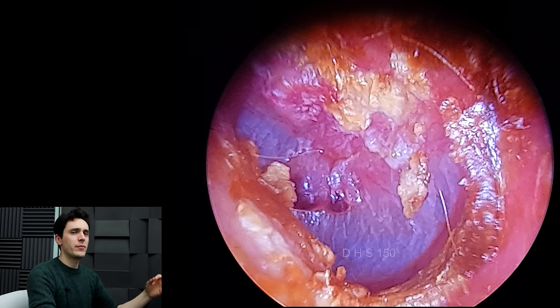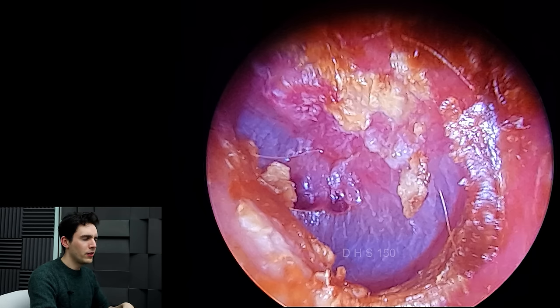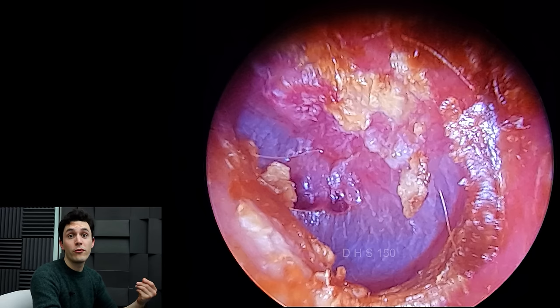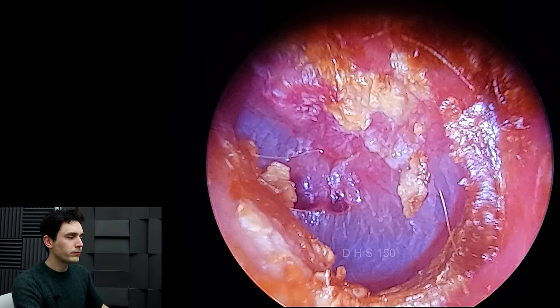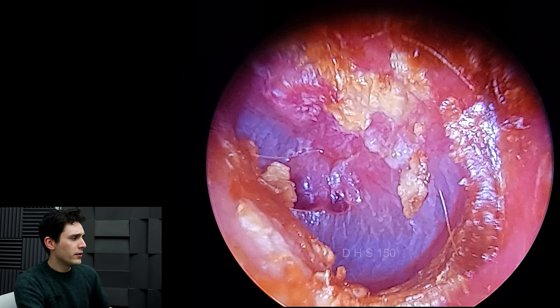And some of you may be thinking — was that due to the suction? Maybe, as I was removing all the debris or suctioning around, I caused that. It is actually quite difficult to time how old the bruises are. But it's certainly not fresh, because if it was fresh it would be bright red. As a bruise or purpura gets older, the blood clots, it deoxygenates, and then it goes a darker colour. You can see that's very clearly purple.